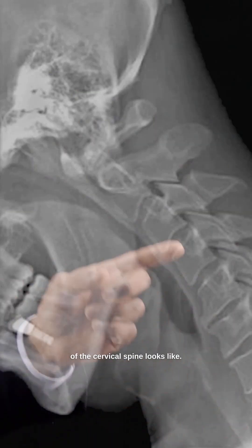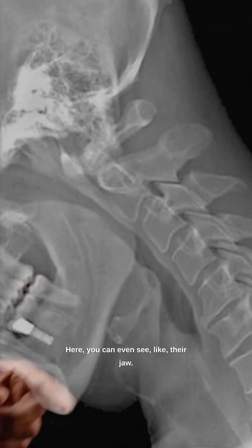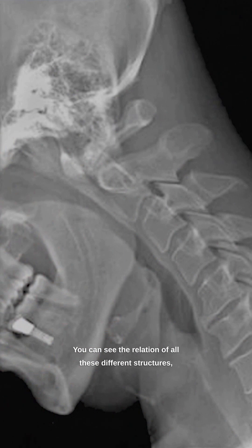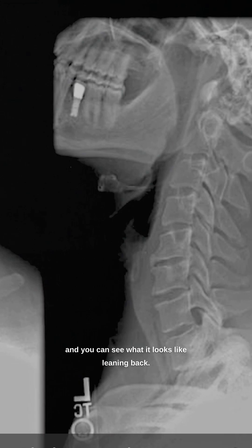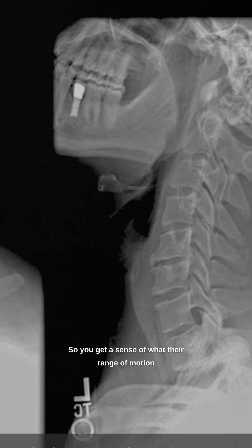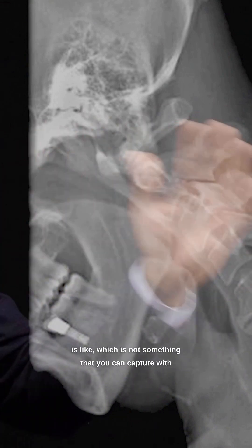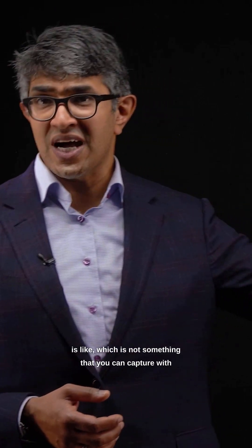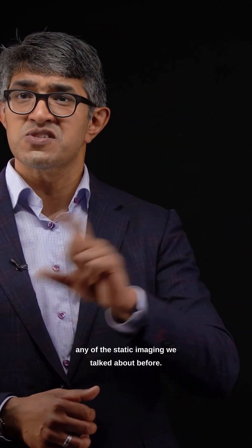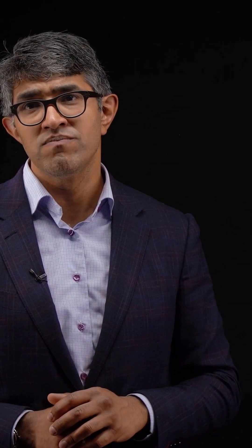You can see what the alignment of the cervical spine looks like here — you can even see their jaw. You can see the relation of all these different structures and what it looks like leaning back. You get a sense of what the range of motion is like, which is not something you can capture with any of the static imaging we talked about before.